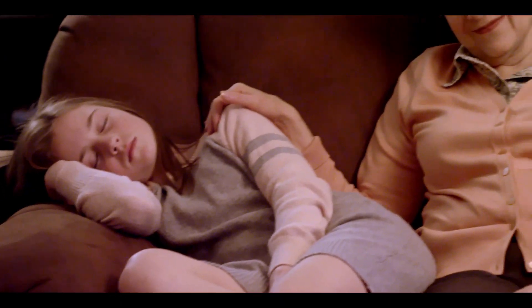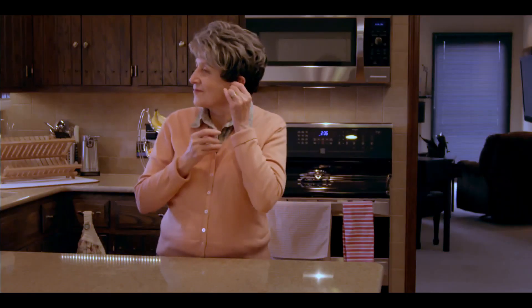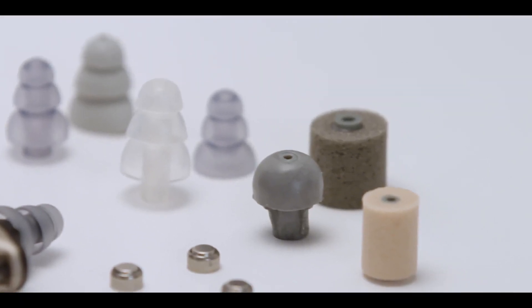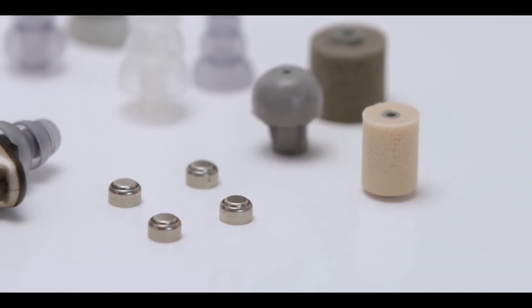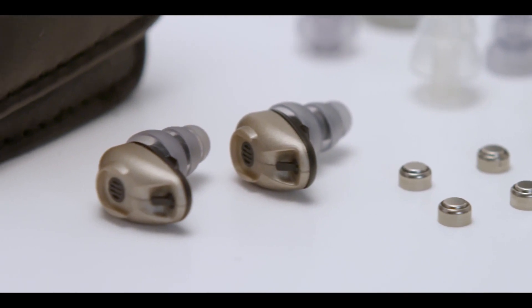Telecoil mode allows sounds to be heard directly from a room loop system. There is an audible indicator to let you know when the battery is running down, and both versions of the Bean will run a week to ten days on a single battery. Everything you need to quickly get started is included in the kit, including multiple ear tips for a comfortable fit, batteries, and a leather carrying case.